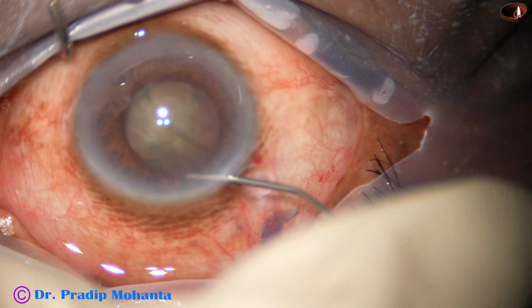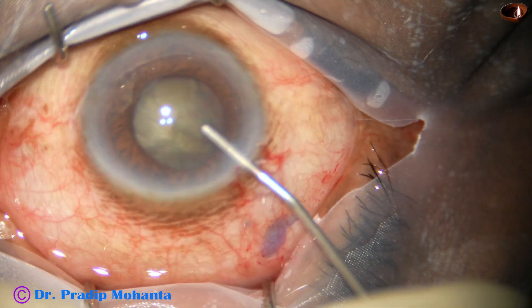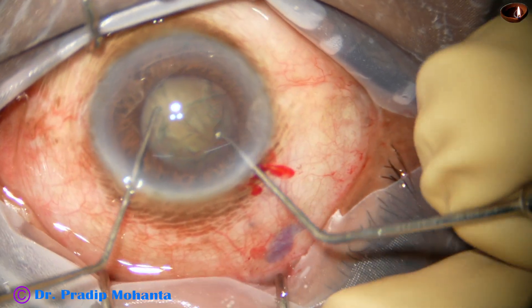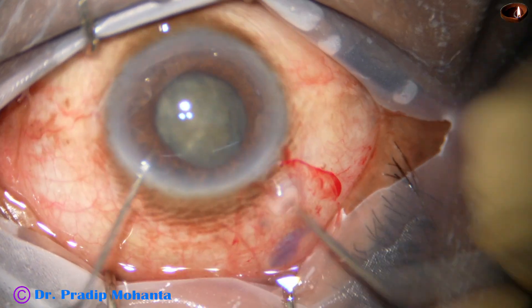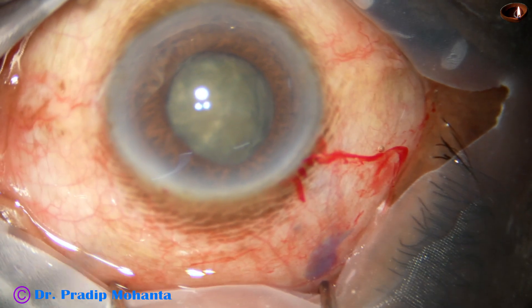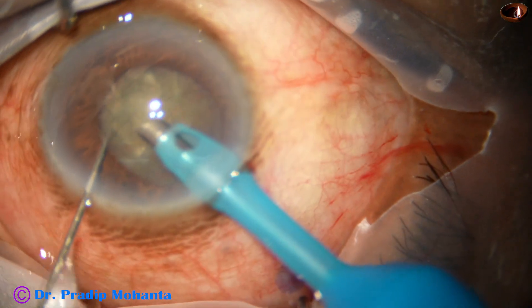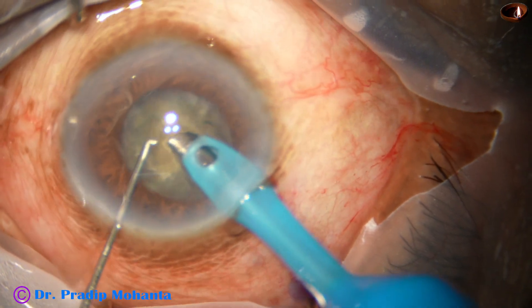Hydrodissection is done at multiple points and the anterior chamber is then filled up with viscoelastic. And now I bimanually rotate the nucleus. In weak zonules, we must always rotate the nucleus with two hooks placed 180 degrees apart. This will cause least stress on the zonules.